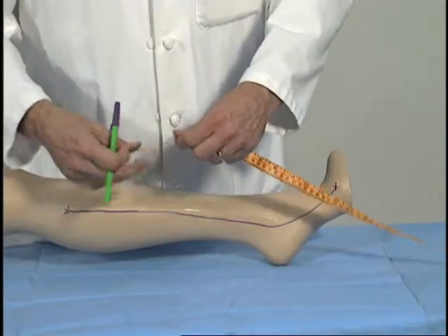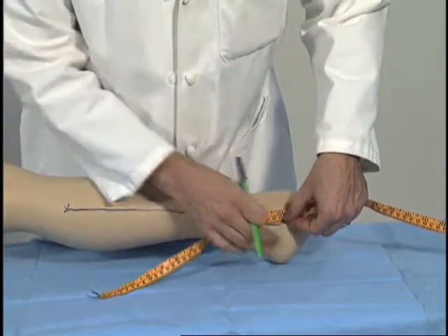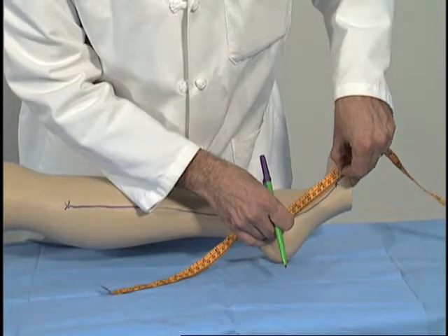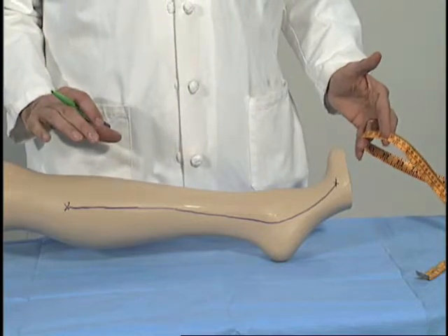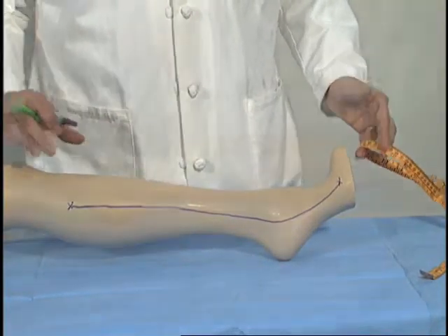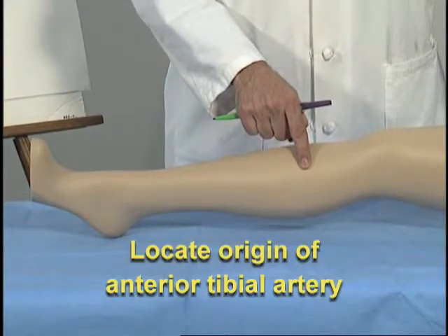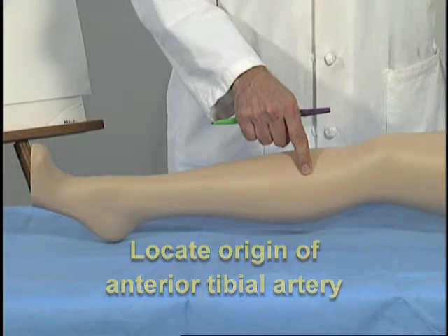You'll then measure the length of treatment identified, which in this case is 42 centimeters, and move next to the anterior compartment. Here, you'll be looking for the origin of the anterior tibial artery, the spot at which it traverses the fascia.